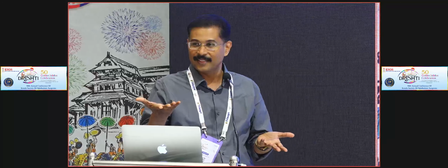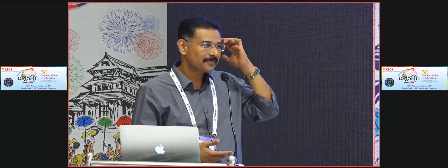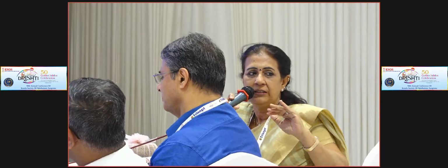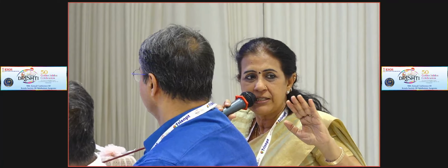So the point is that we need to know whether the lens will be there, accessible to you during surgery on the table. That is very crucial. The other point is, if it is a small area of zonular weakness and you think there is vitreous there, it's important to just gently stain that with Tricort, assess whether there is actual vitreous, and do a very limited vitrectomy.